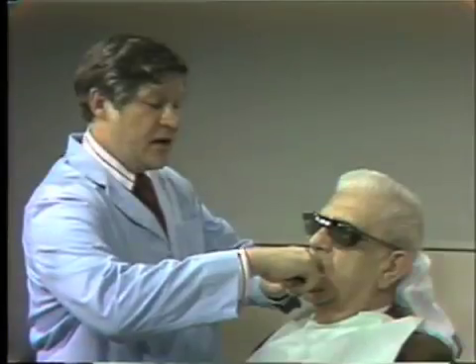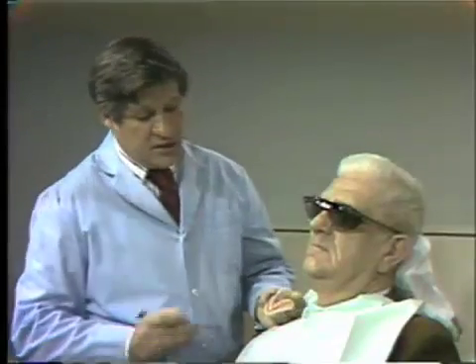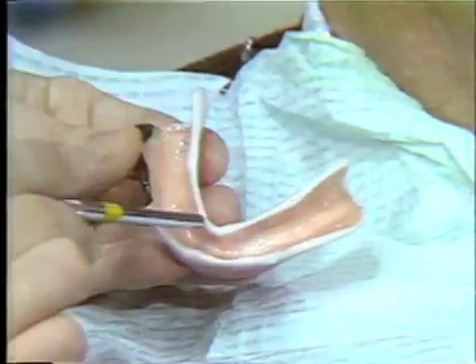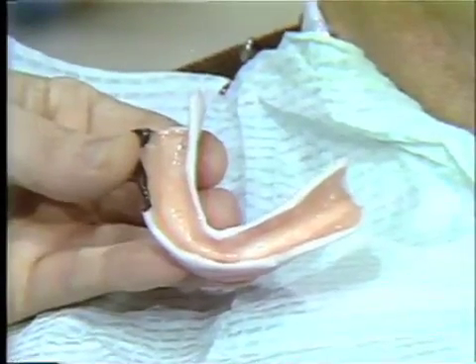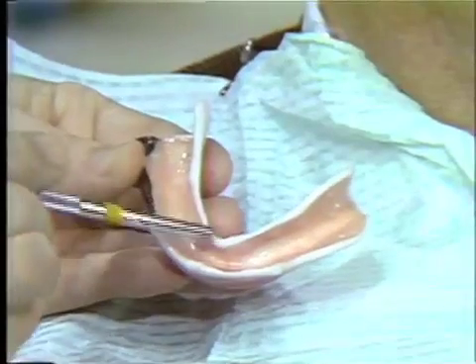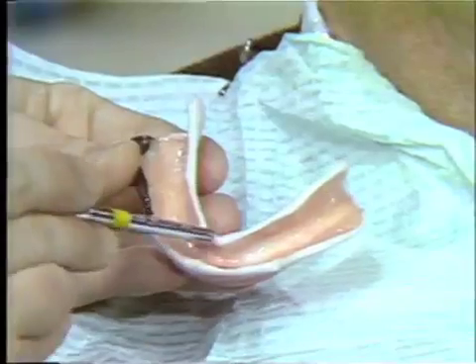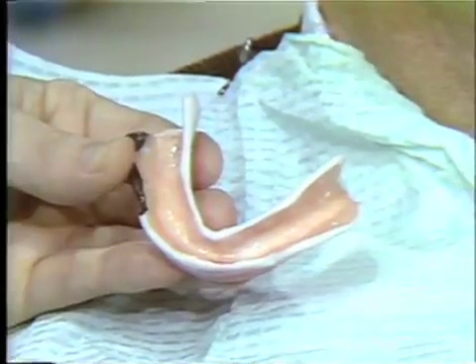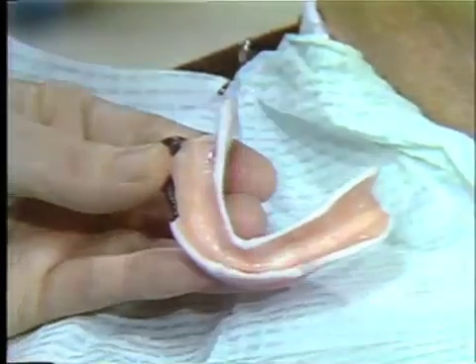One of the most difficult modifications to the tray is the evaluation and the extension of the lingual flange. It is very difficult to tell whether or not the flange is of the proper thickness and the proper length. I like to trim this basically a little short on the preliminary model and then go back and develop the total lingual flanges bilaterally using the compound and the border molding process. I should like to make those extensions at this time.